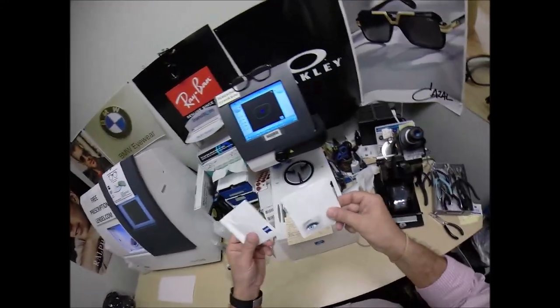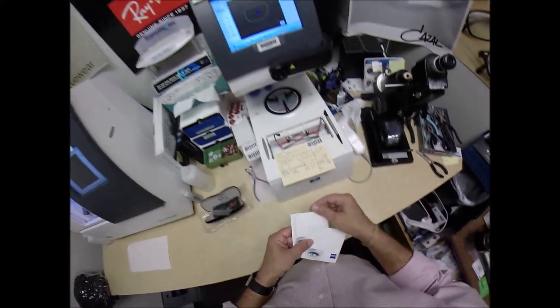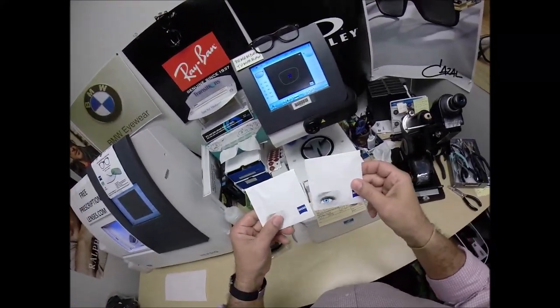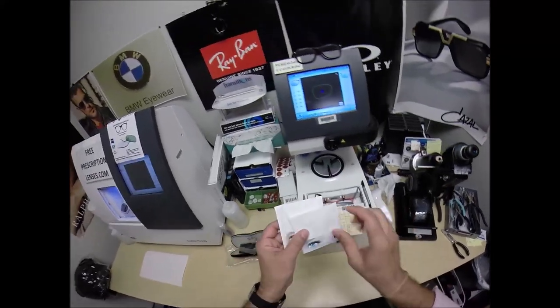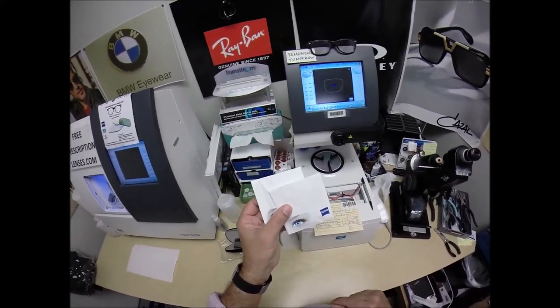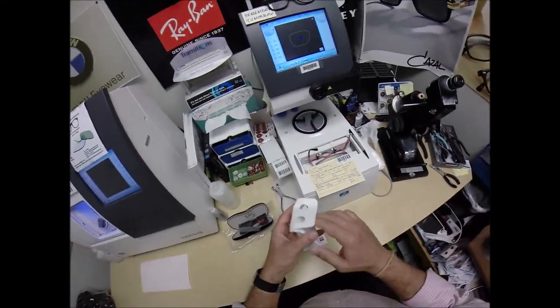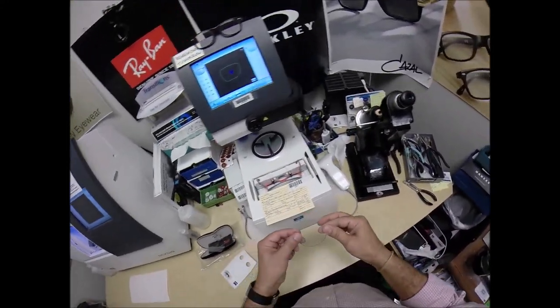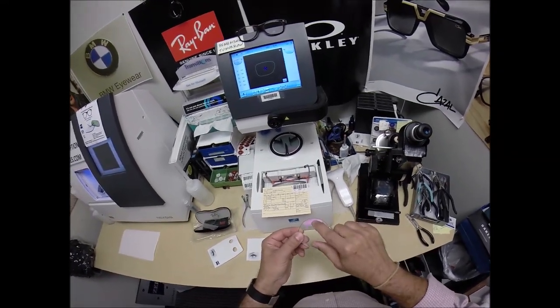Somebody at Zeiss whose job it is to put stickers on the lenses with the features was out sick, I guess. So there are no stickers on these lenses. I don't know which is the right or left — usually they put the patient's prescription information on there. Today I got nothing. I've got a 50-50 chance this is the right lens. Actually, I think this is the left — they actually do engrave things on there.